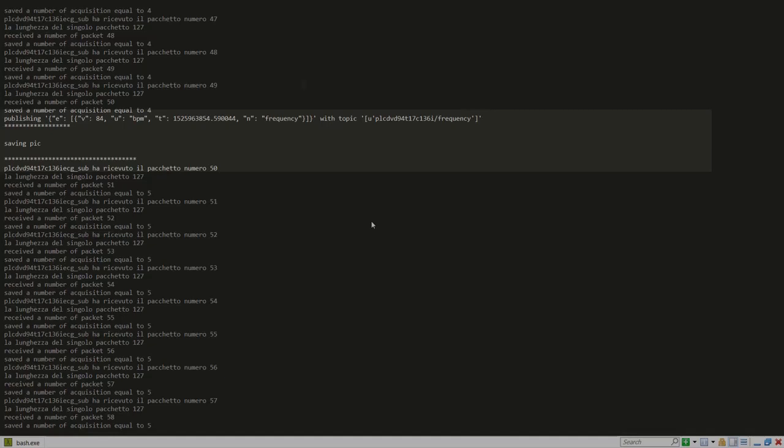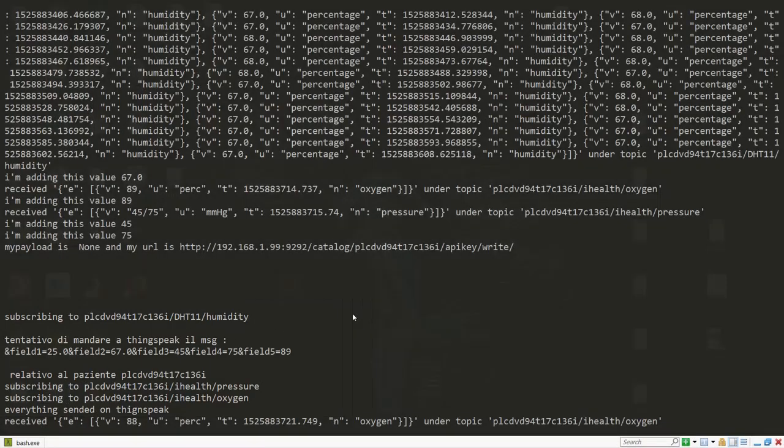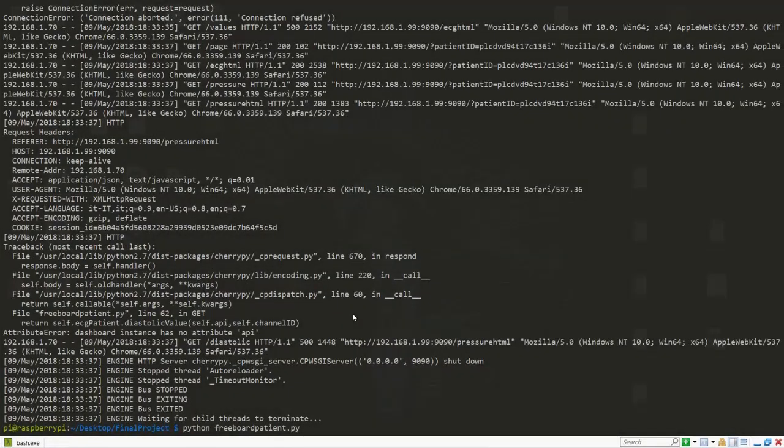It also sends a message under the frequency topic related to the specific patient, in which the actual frequency is reported, in this case 84. This message is useful for the alarm sender, which will send a message to Telegram. As we can see, while the ThingSpeak adapter is sending everything to ThingSpeak, we can run the Freeboard dashboard.